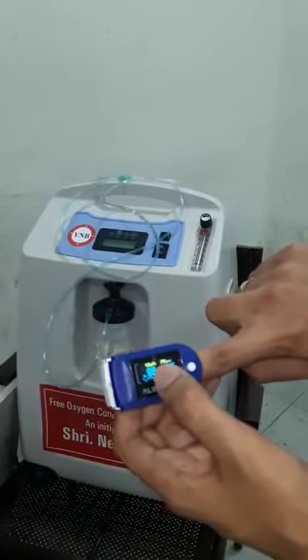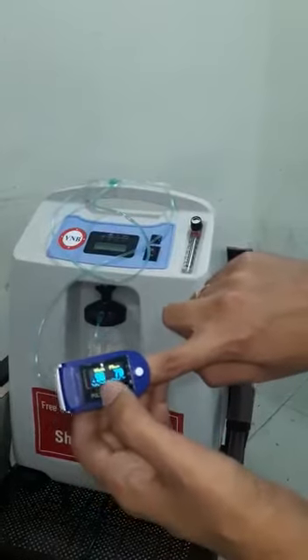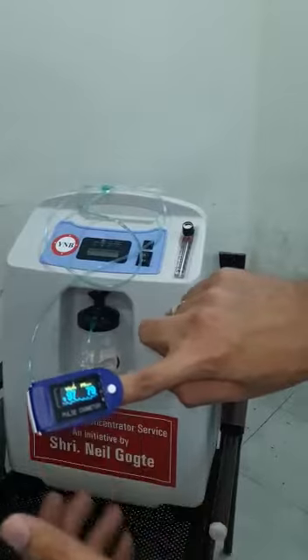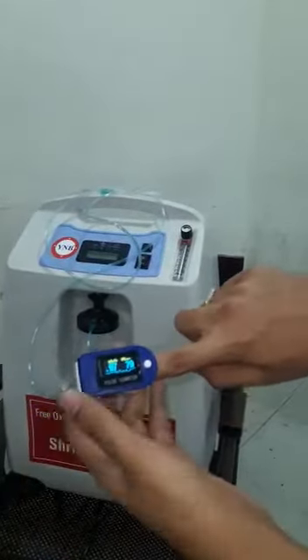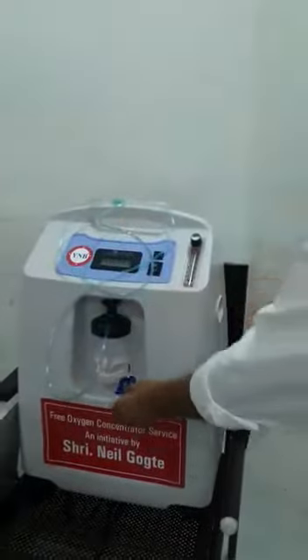If SPO2 is showing less than 80 or 82, then it is better to refer the patient to the hospital. And if the pulse rate is showing more than 120 or 130, then probably he needs high flow oxygen — this machine may not be enough. This is what will guide you on how to and whom to use it on.